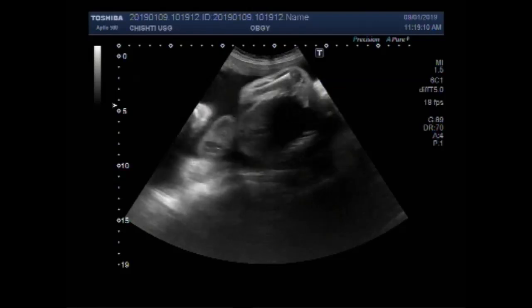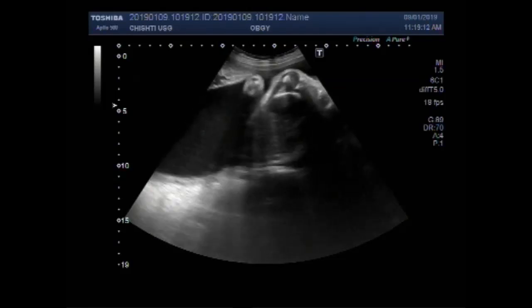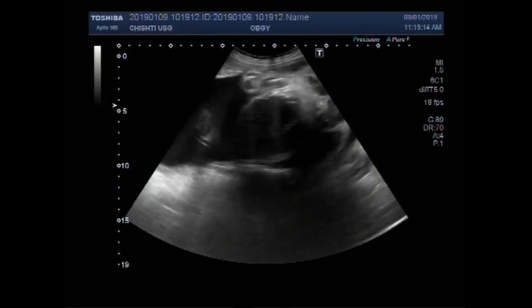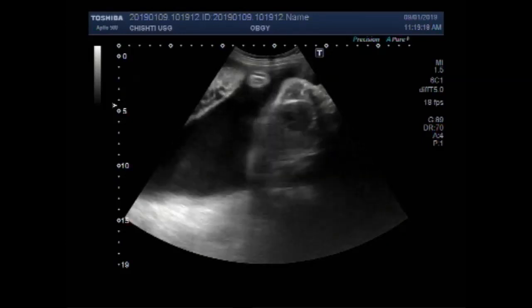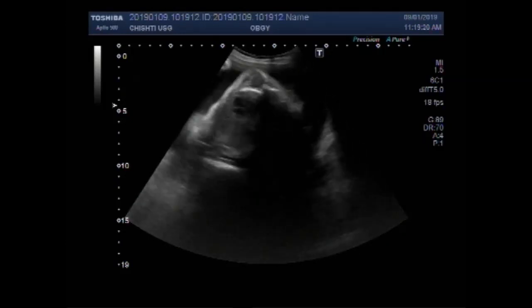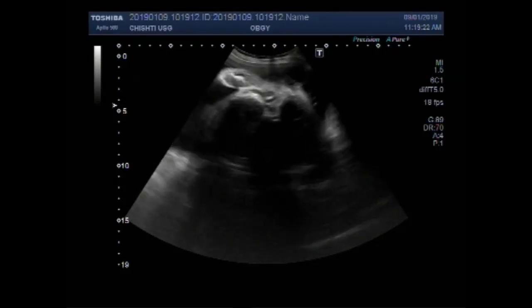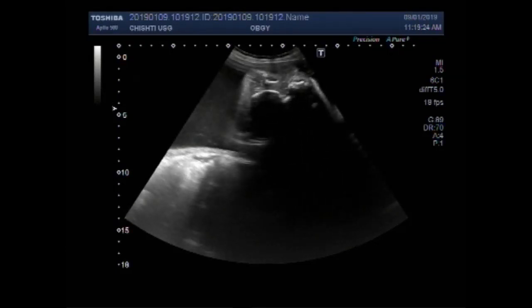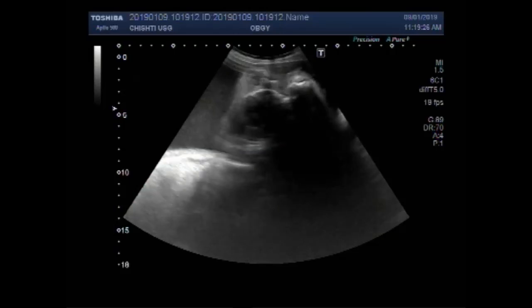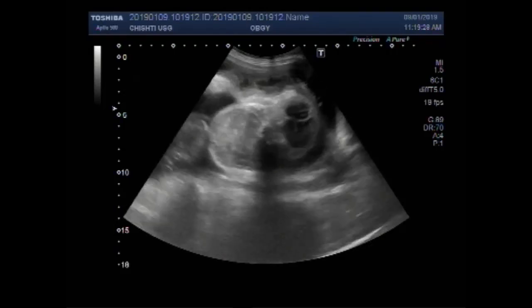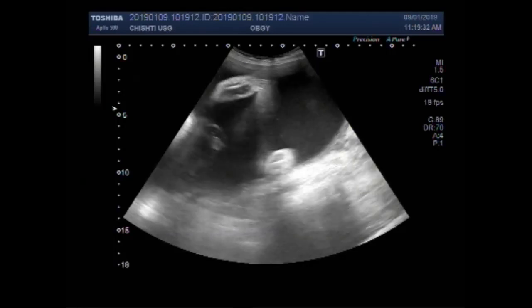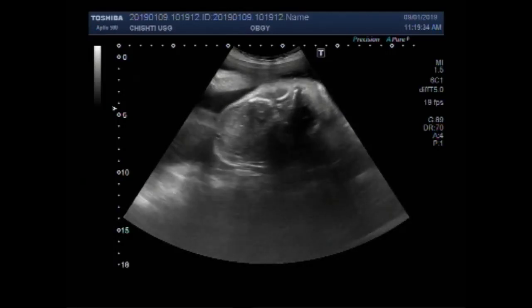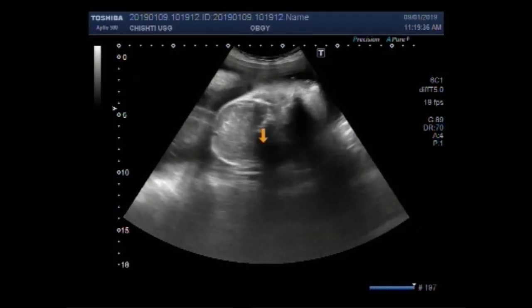Now you can see the fetal cardiac activity. This is the fetal abdomen.